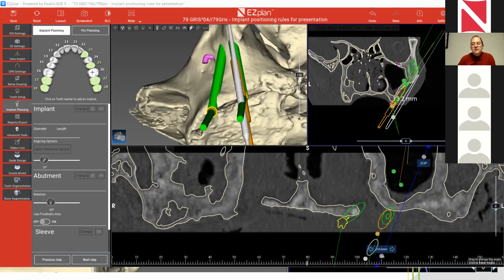It's not always possible, because once we've drilled, we remove the bone from the position we drill. Then when we drill again, the implant actually has less bone, or it will not hold. But in this case, on the spot, you have to decide what to do. So there's not a good answer for that.